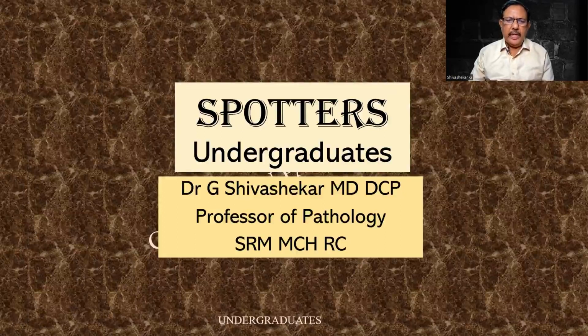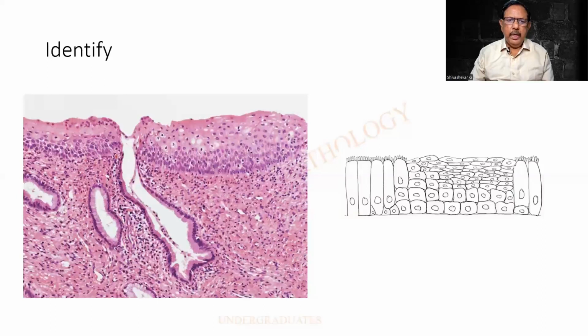The topic is staring at us. Now, let us not waste much time. I would like you people to kindly identify the structure. Also, compare it with the diagram that is given over here. I hope you can identify ciliated columnar epithelium and then the tile-like squamous epithelium.